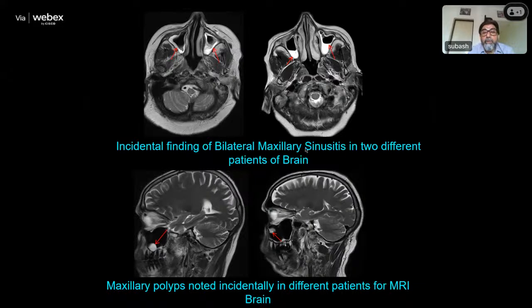So this is sinusitis, which you all know. These are the sinuses, and they are supposed to be gaseous, only air-filled spaces in the skull near the nasal cavity. They are supposed to be only dark black regions. But there's a fluid accumulation. We see sinusitis. This shows the bright liquid accumulation in these areas, where you have sneezing and headache, and all those things happen to you.